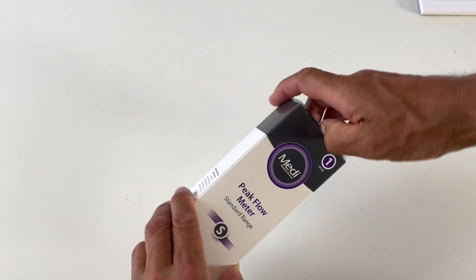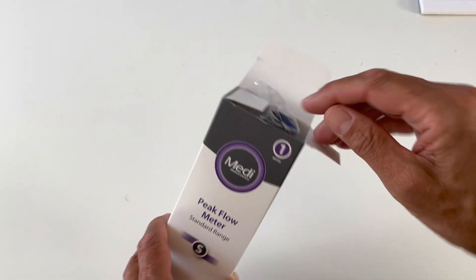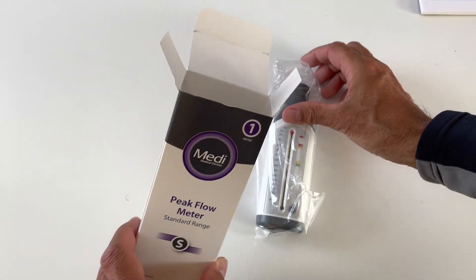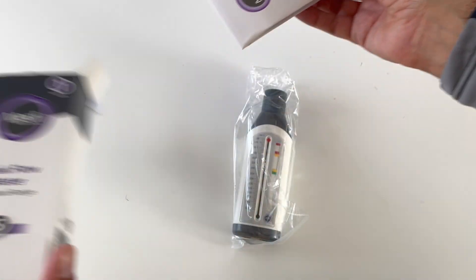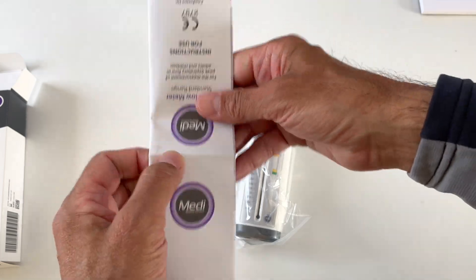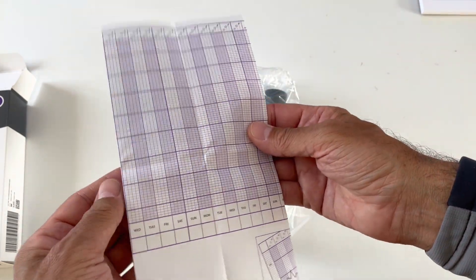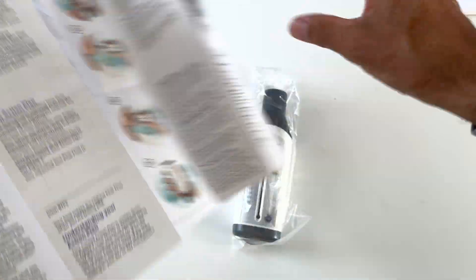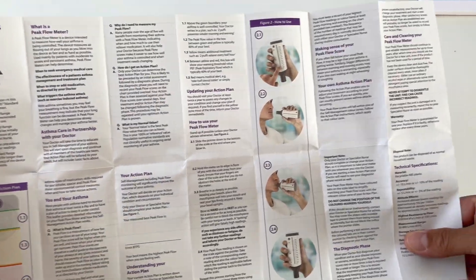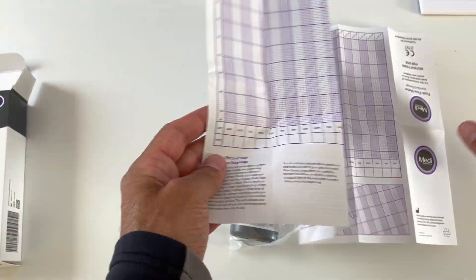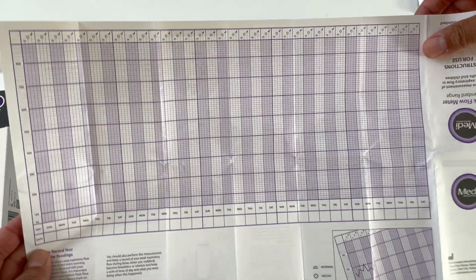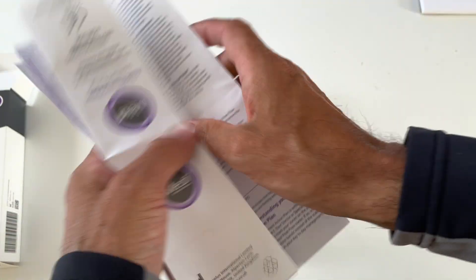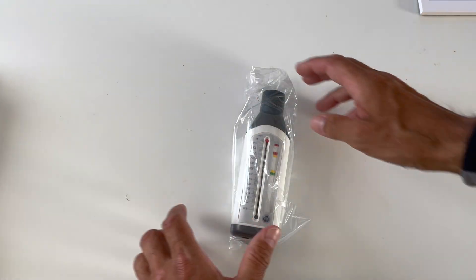So in the package is a meter, there's a brochure with some explanations of how to use it. And there's a chart so you can record your results. Now, we put that away. I'm just going to concentrate on the meter itself.